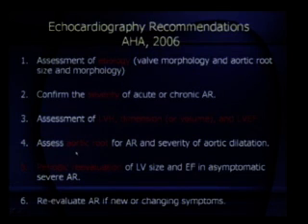Mind you, assessment of aortic root is as important as assessment of left ventricular hypertrophy or function, because if the root is dilated beyond a certain point, then you are not just going to replace the aortic valve, you will also have to think in terms of replacing the aortic root. Periodic reevaluation, that's where the real strength of echocardiography comes in.